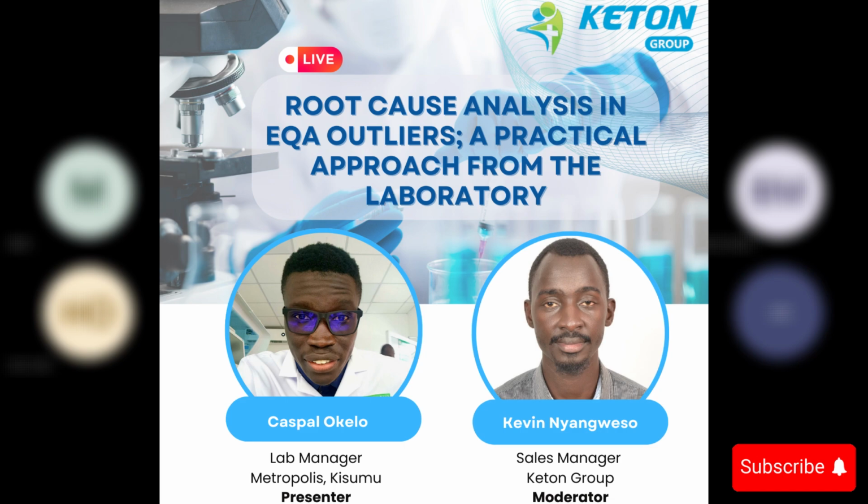Another question from Musumba is asking, at what point do you conclude that the error is random? So I mentioned that after structured checks, if there is no evidence of a systematic problem, if it's a single isolated event, you've checked that your QC before and after the event was stable, there was no shift, there was no trend, there was no reagent change, no calibration, no maintenance, no lot changes, and there's also no similar issue among other analytes, and the subsequent EQA or repeat testing is acceptable.